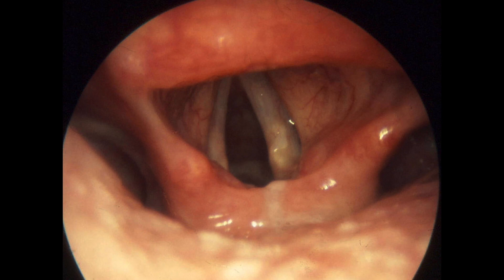Here's a picture of a normal glottis. The vocal cords are the upside-down V in the center. This is the view we want when we're intubating a patient.